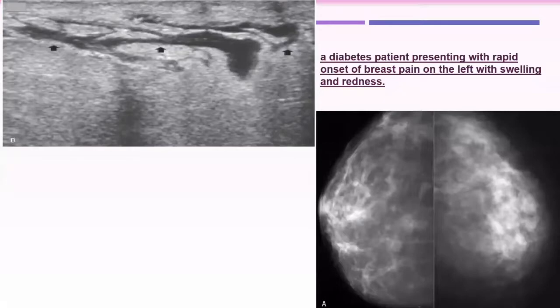The subcutaneous fat becomes hyperechoic, with lack of differentiation between the tissues. And there are dilated ducts. Are these ducts or subcutaneous lymphatics? Yes, it is subcutaneous lymphatics, because it is subcutaneous, not within the breast glandular tissue, and in the setting of this edema.